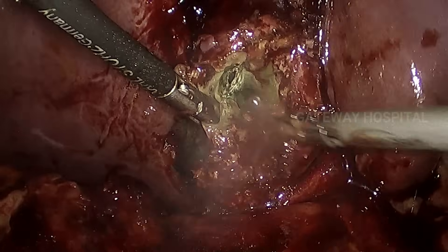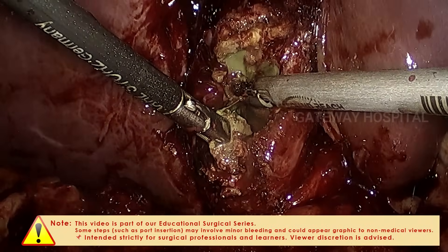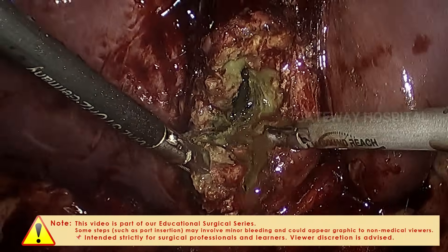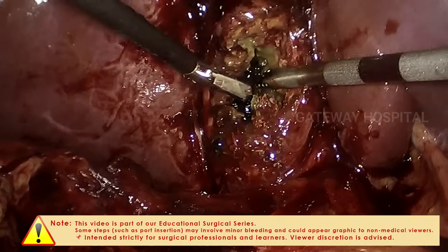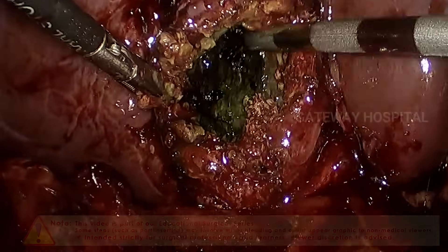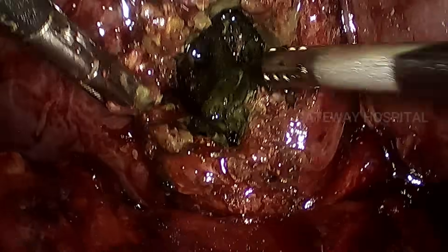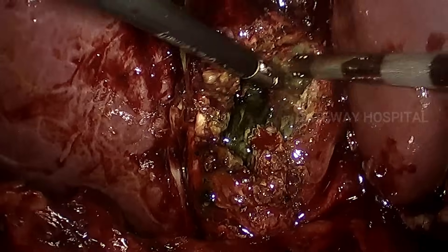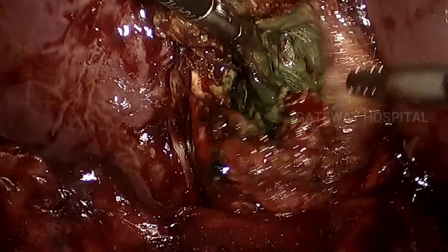Once divided, you can use suction to identify the depth of the infundibulum that is remaining. A main important point while doing this technique is you have to identify all the stones and carefully retrieve each and every stone without losing them in the peritoneal cavity. The suction nozzle dissects a plane between the gallbladder and the surrounding structures.